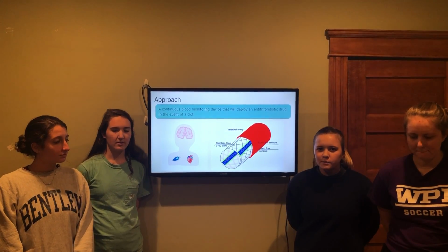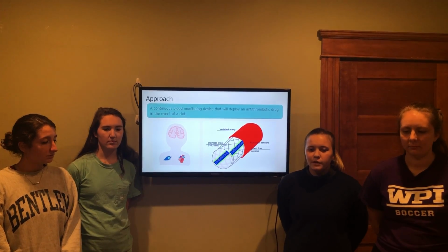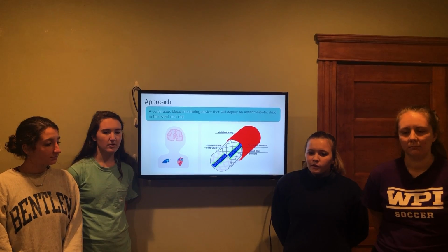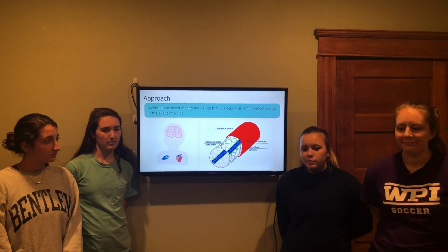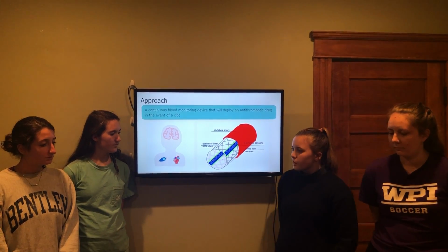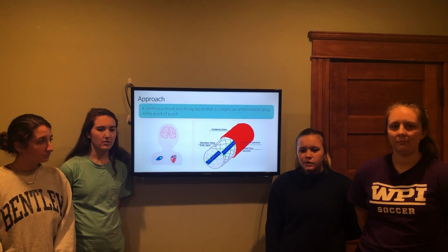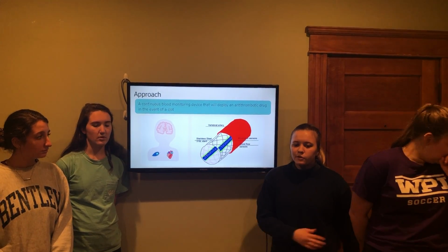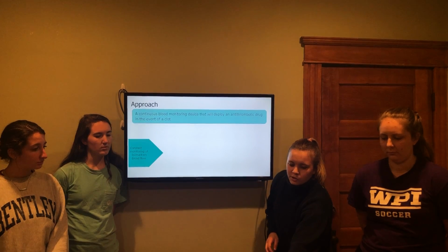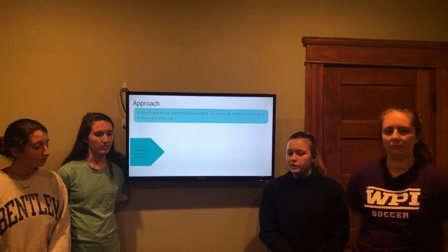Our solution to this problem is a continuous blood monitoring device that has sensors embedded in a smart stent located in the vertebral artery. The sensors measure various components of the blood and send this constant data to a receiver which is located on the right side of the chest underneath the collarbone. At certain stroke indicating thresholds, an antithrombotic drug would be delivered to the patient, and the device flow process starts with the constant monitoring of blood biomarkers as well as the blood flow rate.